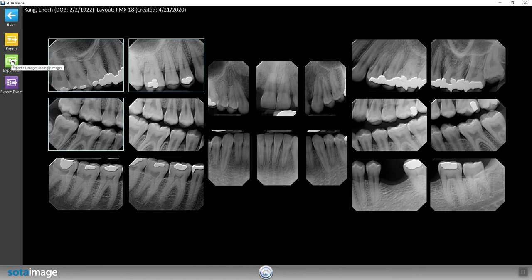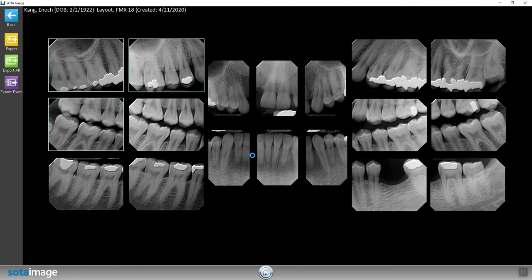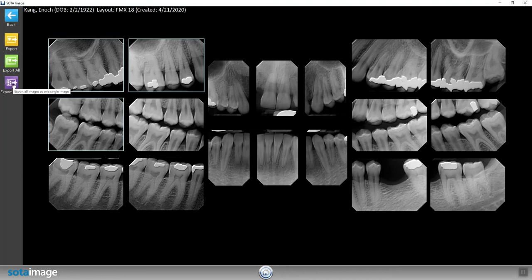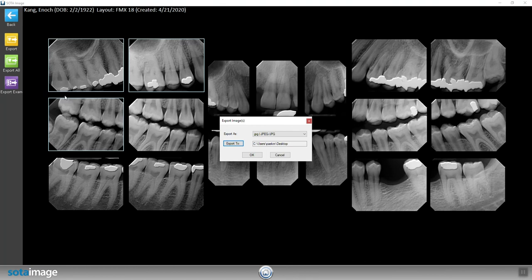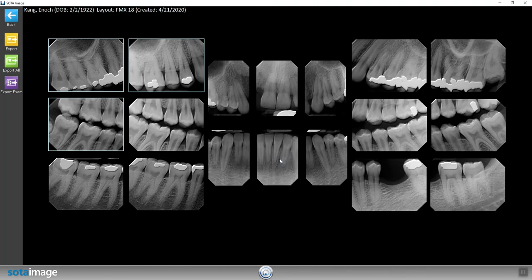Now let's go ahead and export all of the images into one folder. And let's export the exam to see what this all looks like. After the export is successful, navigate to your desktop to view the images.